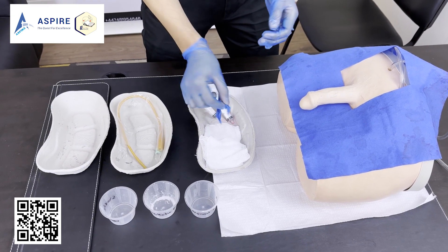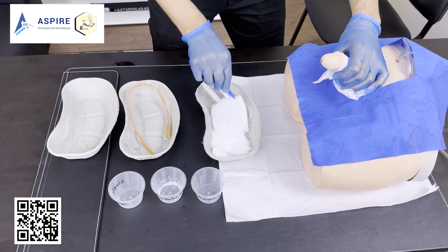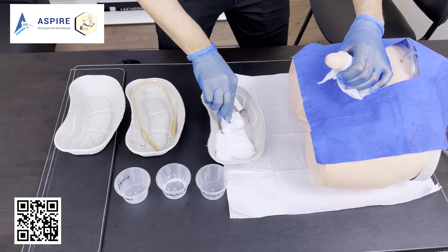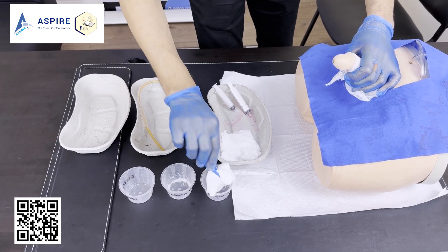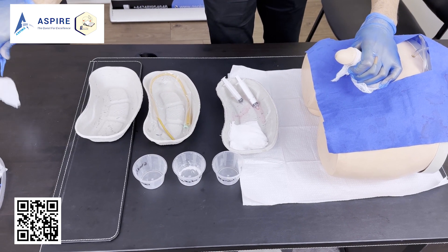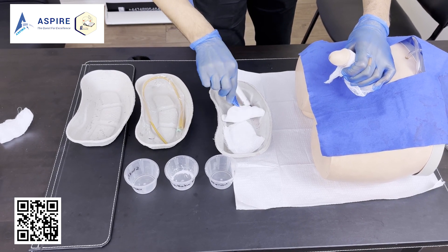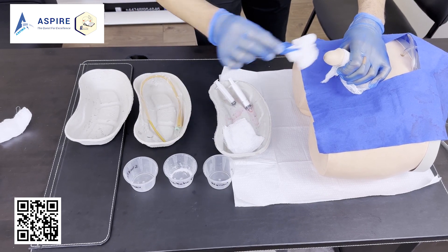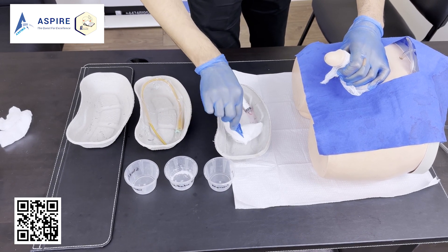Take your forceps and gauze piece and begin cleaning the penis. We clean it three times — dip the gauze in normal saline or antiseptic, clean once, then dispose it in the waste area. Repeat this process a second time, then a third time, ensuring thorough cleaning before proceeding.